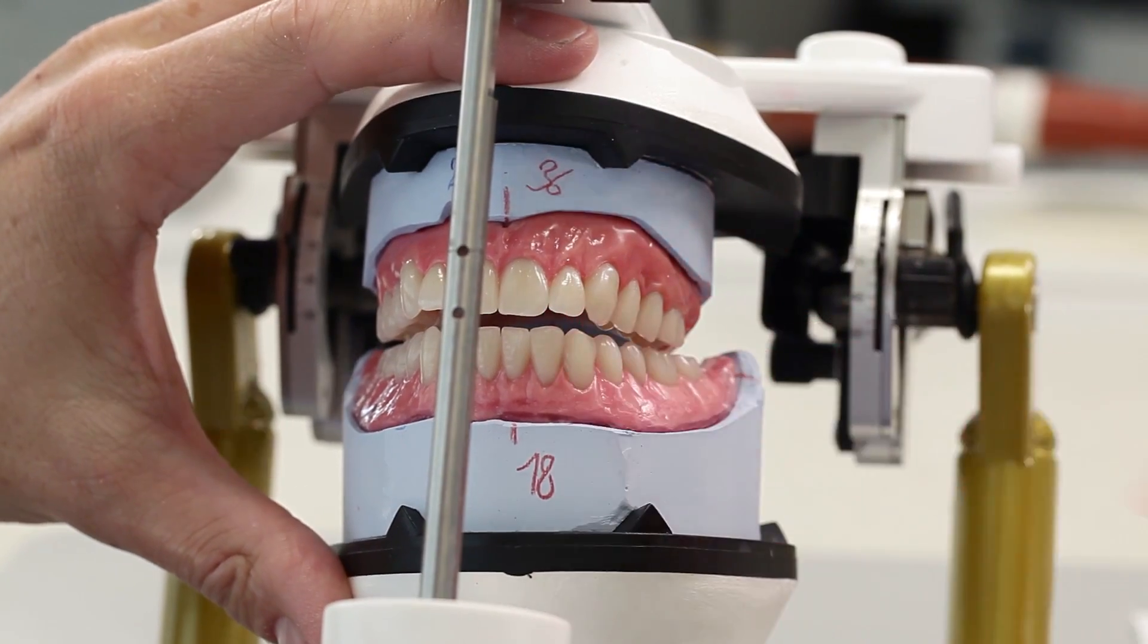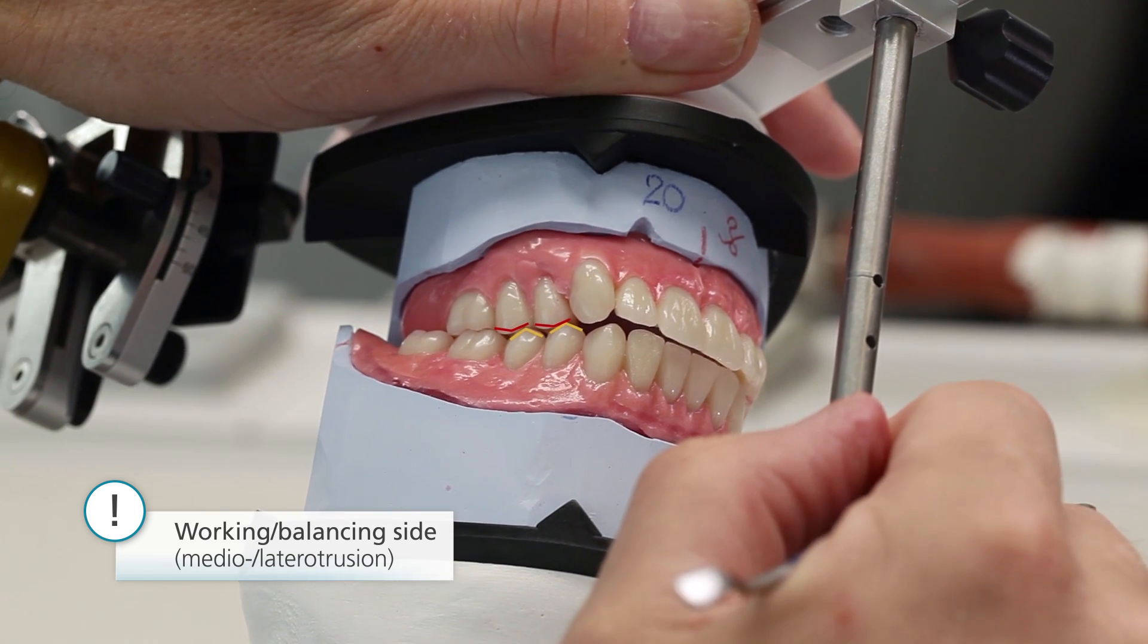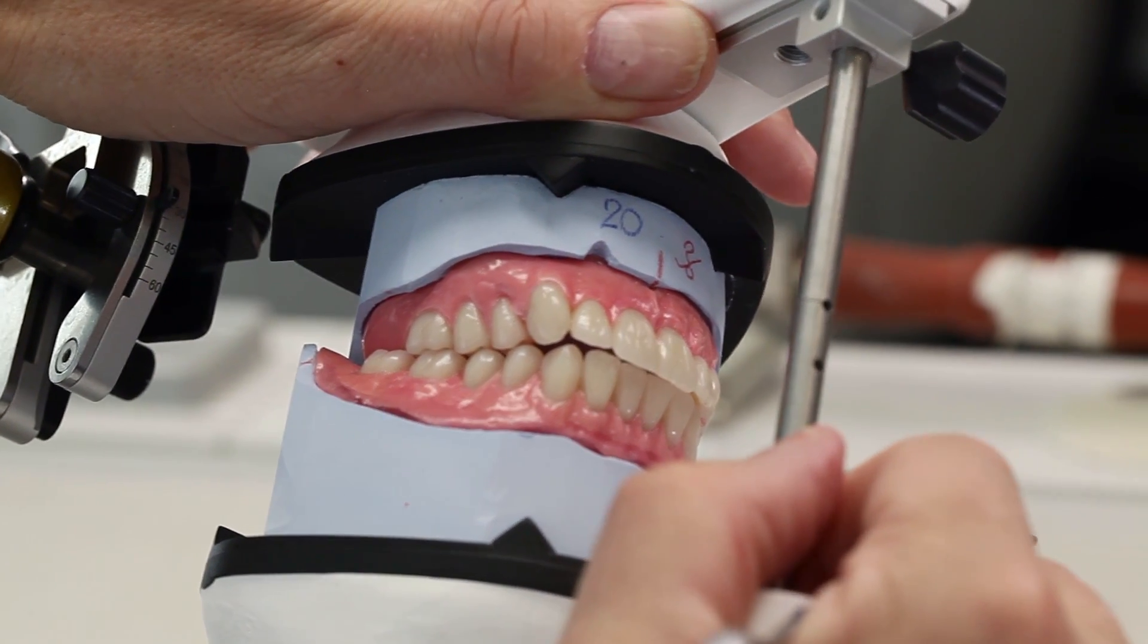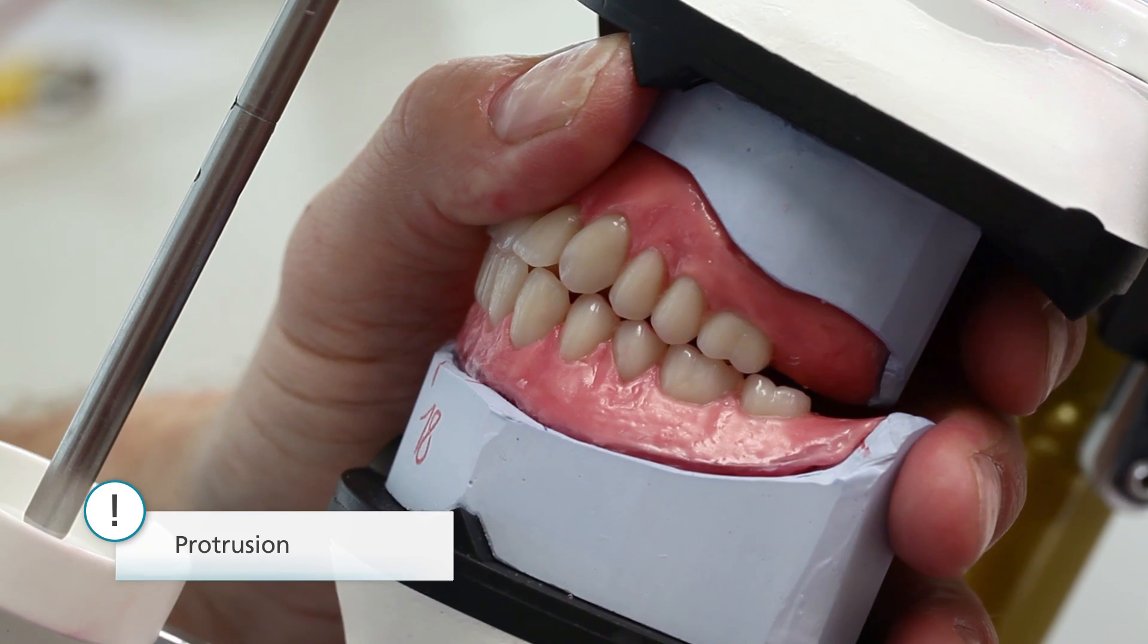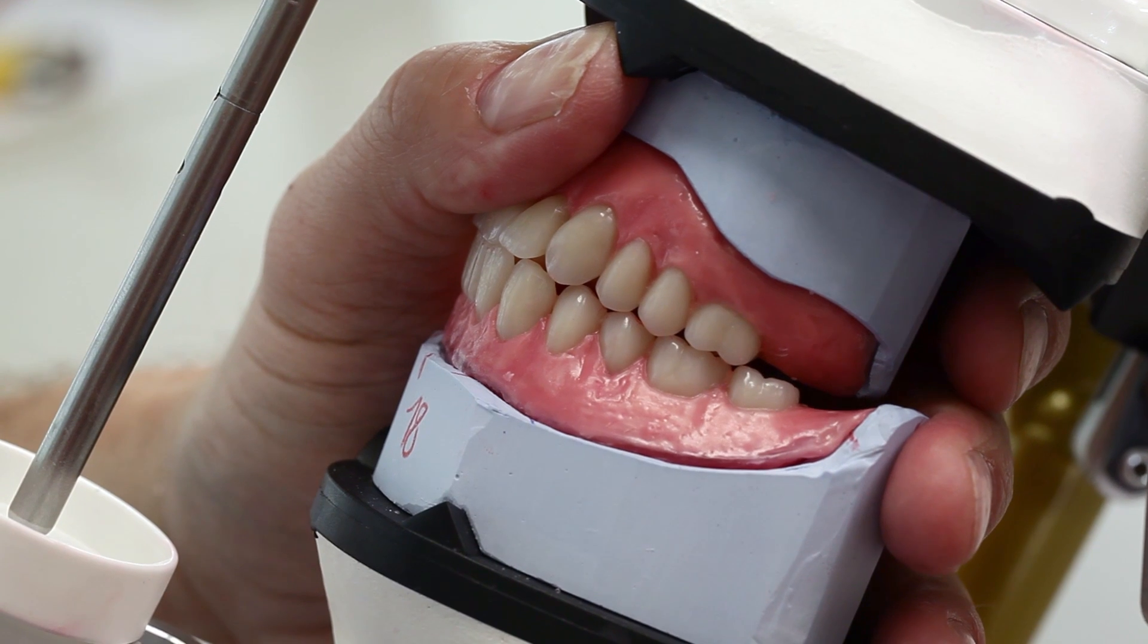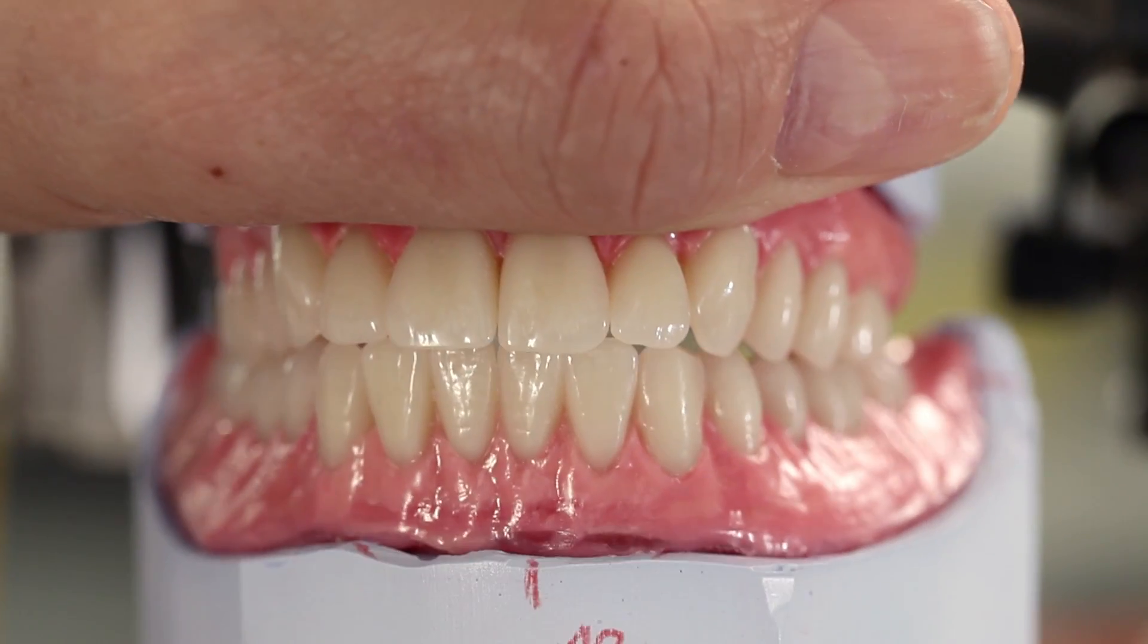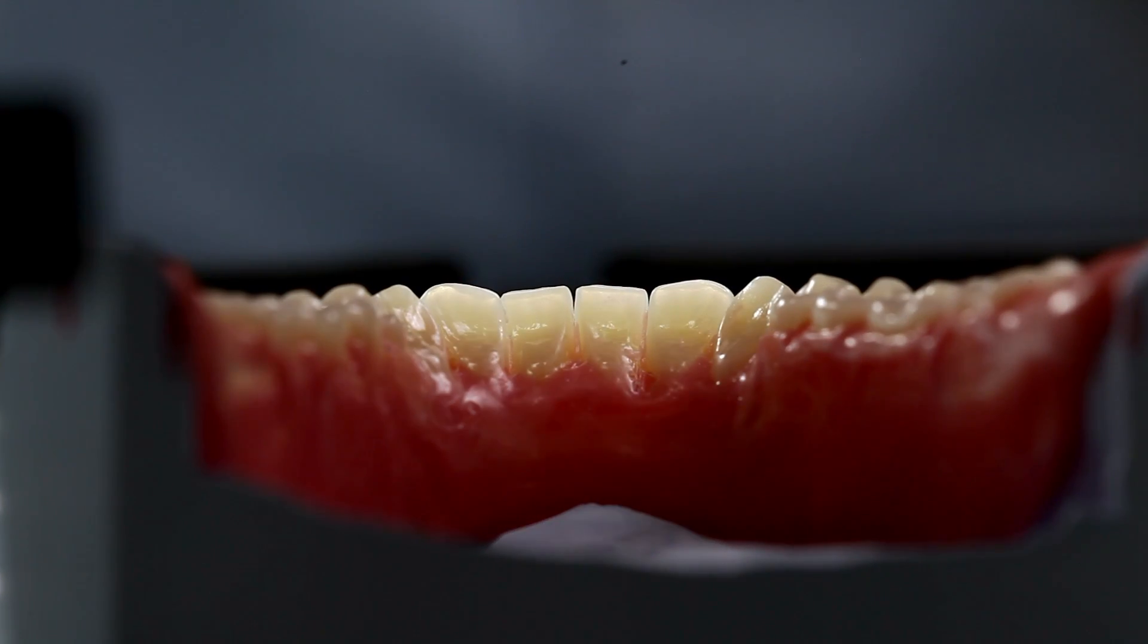Check whether the buccal mesial surfaces of the upper premolars slide over the buccal distal edges of the lower premolars on both sides. The mesiopalatal cusps of the upper molars slide on the disto-buccal cusps of the lower molars. The disto-buccal facets of the upper premolars slide over the mesiobuccal facets of the second premolar and the first molar. Set up or grind in the anterior teeth in such a way that they come into group contact with the posterior teeth. Premature contacts must be avoided. Prevent a mere anterior and canine guidance in any case.